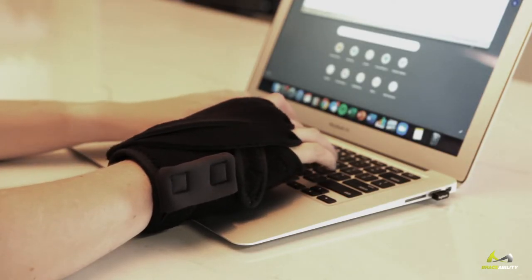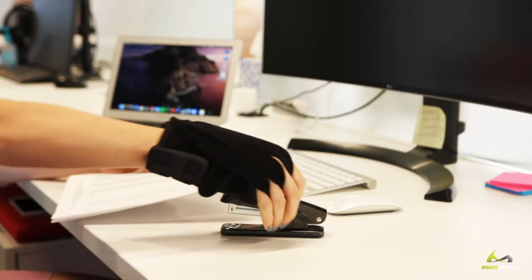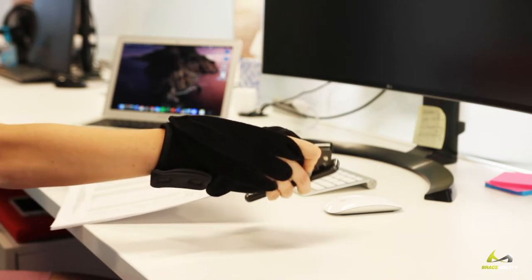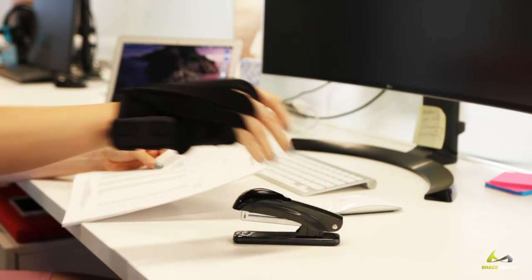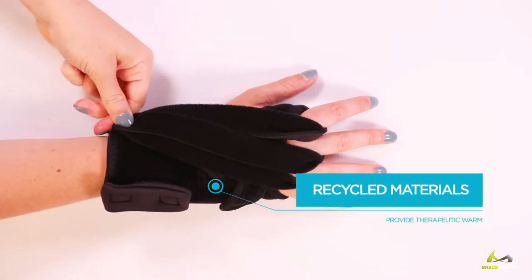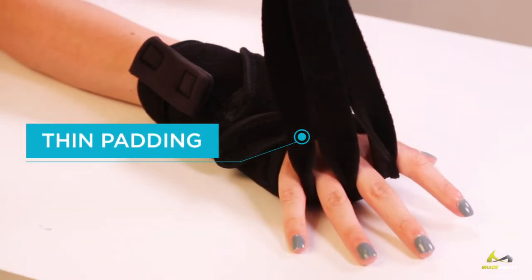In addition to straightening your crooked fingers, our splint stabilizes your wrist, slowing the progression of deformity and restricting harmful wrist and hand movements. It leaves most of your fingers free, preserving safe mobility of your hand. Made of recycled materials that provide therapeutic warmth, soothing sore and stiff knuckles. Thin padding provides a comfortable and non-bulky fit between your fingers.